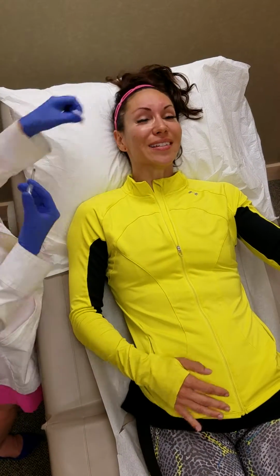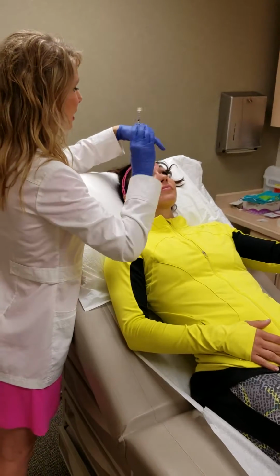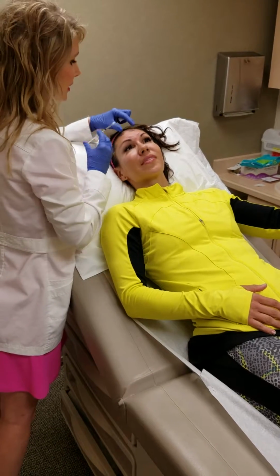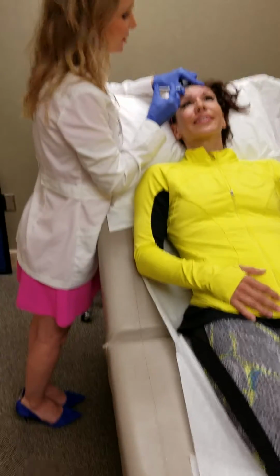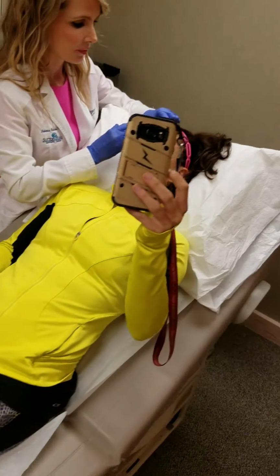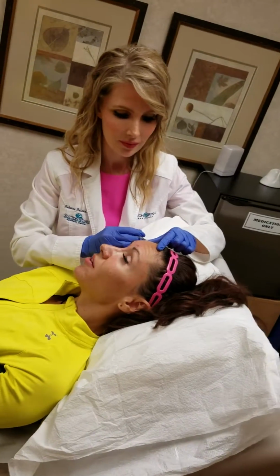And the cool thing is, I'm gonna have this done and walk out the door and go grocery shop. I'm gonna get diluted things done. Forehead. Forehead to soften these, and these pretty much go away, don't they, Maggie? Yeah, absolutely. Here we go. So I haven't been here for very long, and we did a little bit of numbing before the filler, and then now we're doing the Botox.